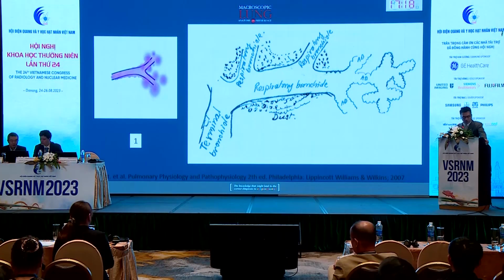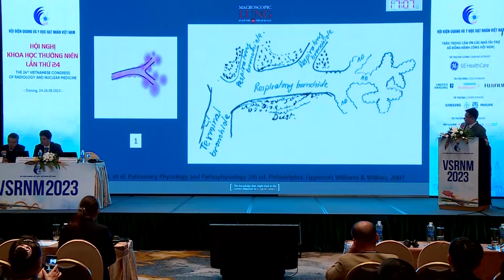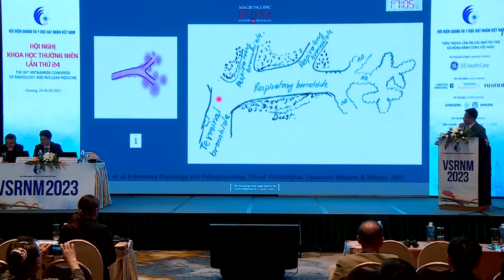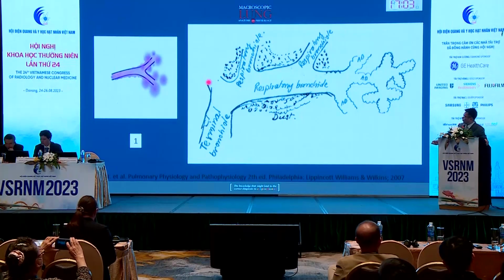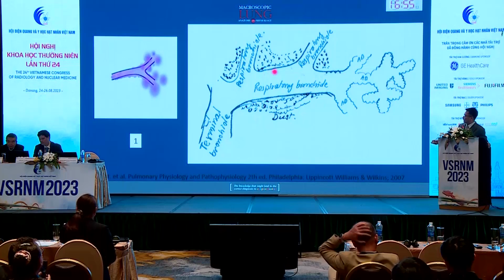I would like to start with the first stage, centrilobular nodules. I would like to touch on the basic histology of the bronchiole. At the area of the terminal bronchiole, this is the place where the inhaled gas reduces its velocity to zero, giving suitable air for gas exchange.